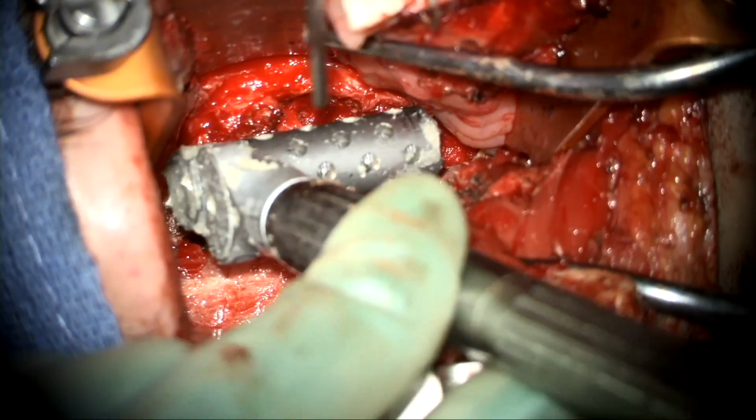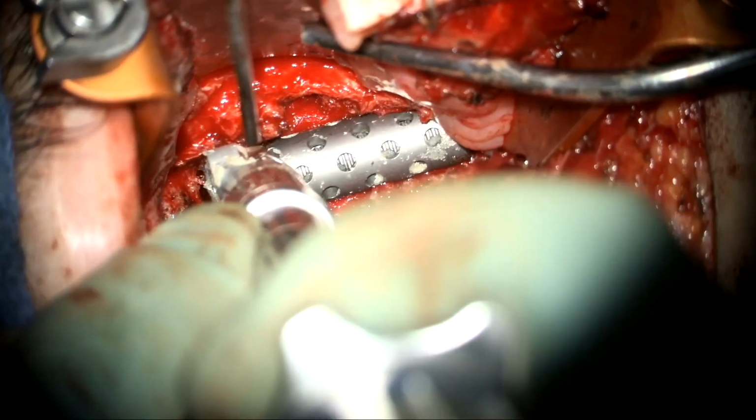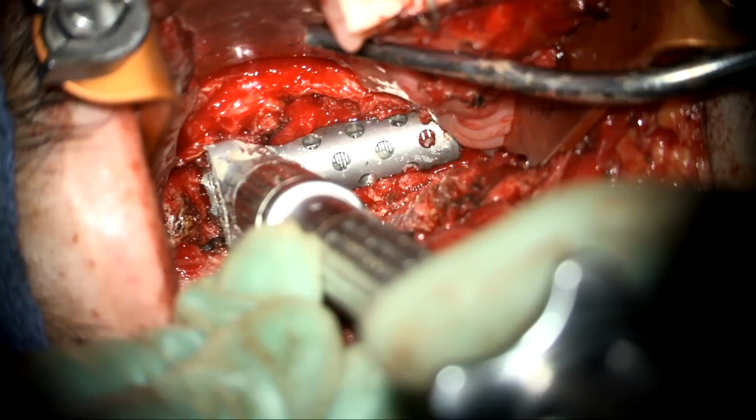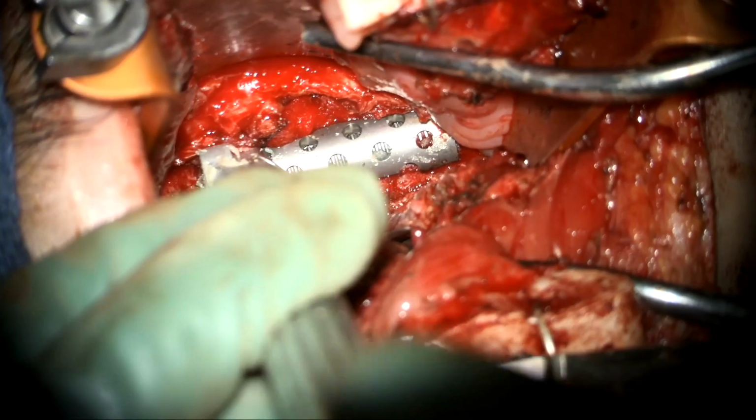The cage was placed against the superior end plate of the C5 vertebral body and the remaining dens and C1 anterior arch.